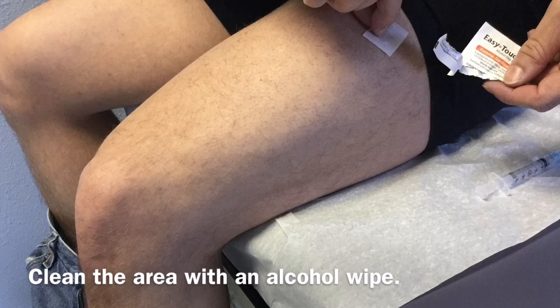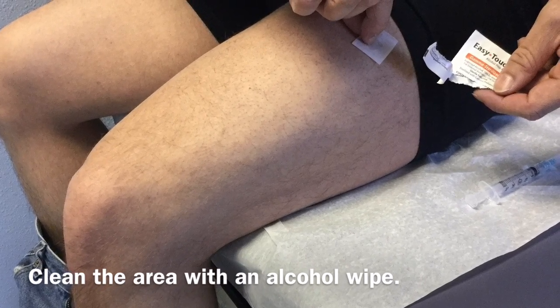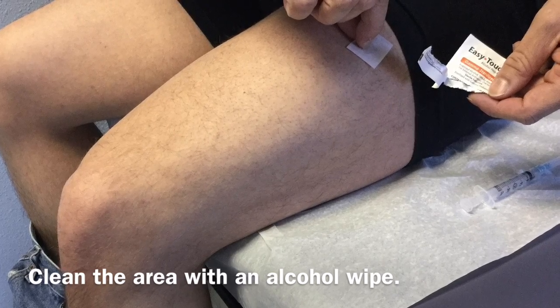Once you've located the location where you will inject, go ahead and clean the area with an alcohol wipe, and let that dry.